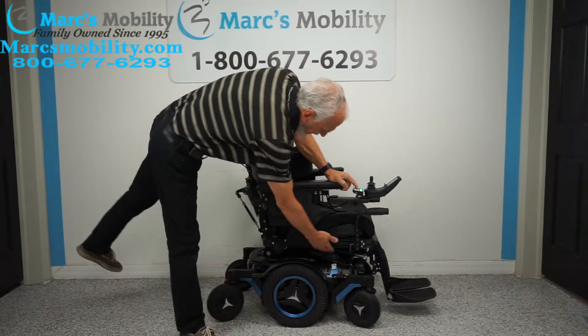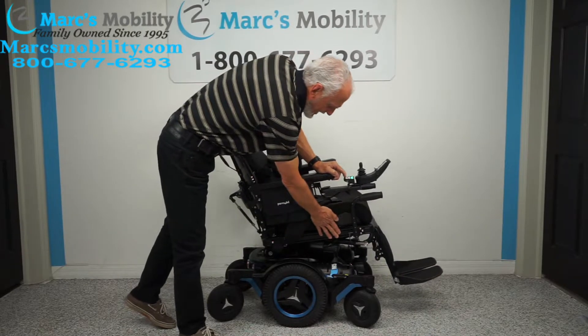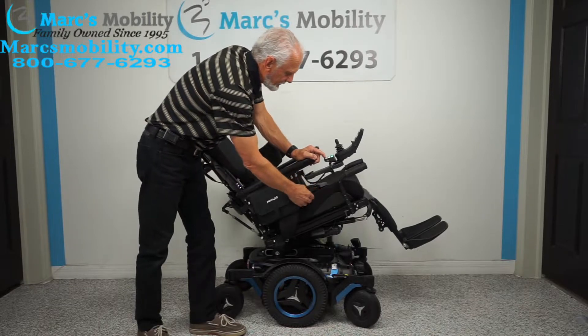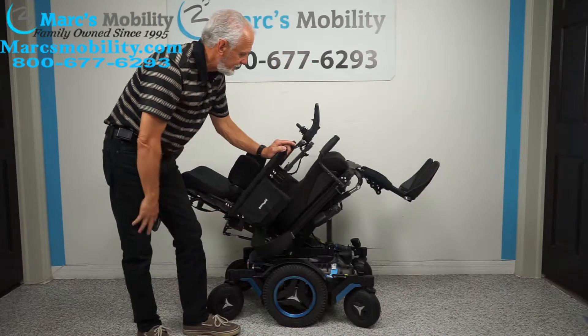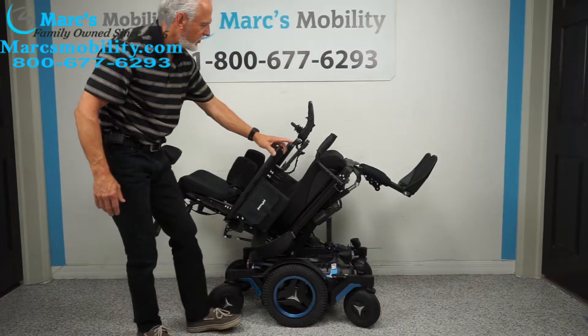The next feature is called electric tilt. The electric tilt is when the base goes back — and when that base goes back, it takes the leg rest and the back with it, as they're all connected. This is good if you want to take pressure off your bottom or back, have circulation in your legs, or just want to relax.